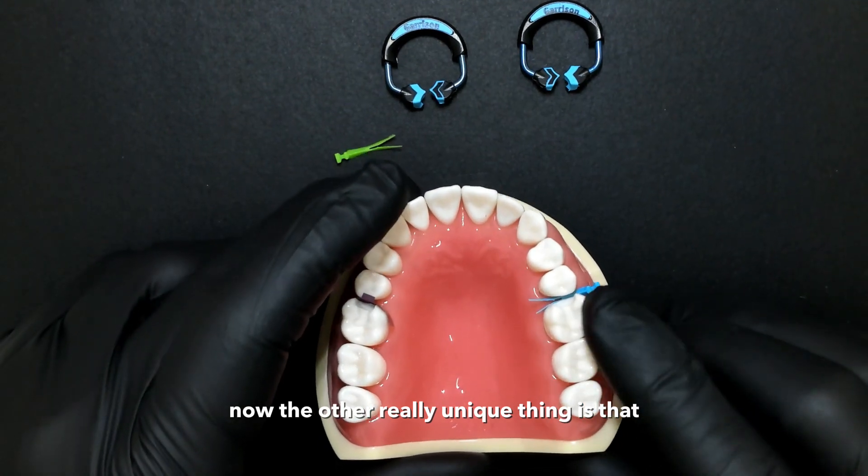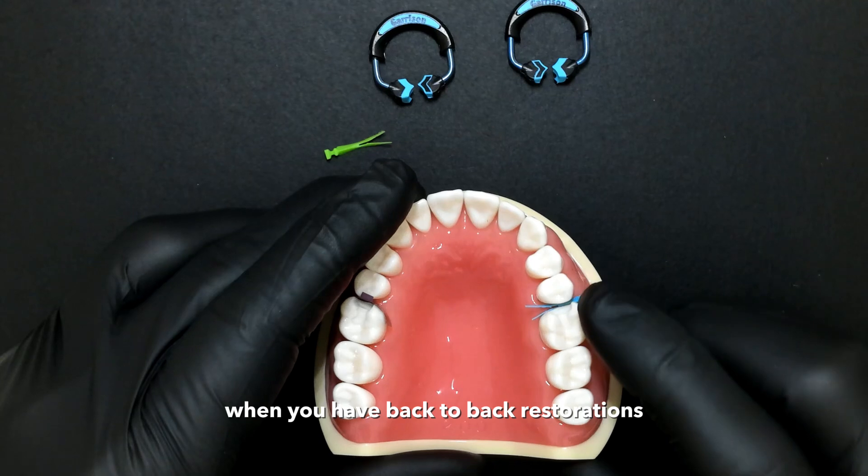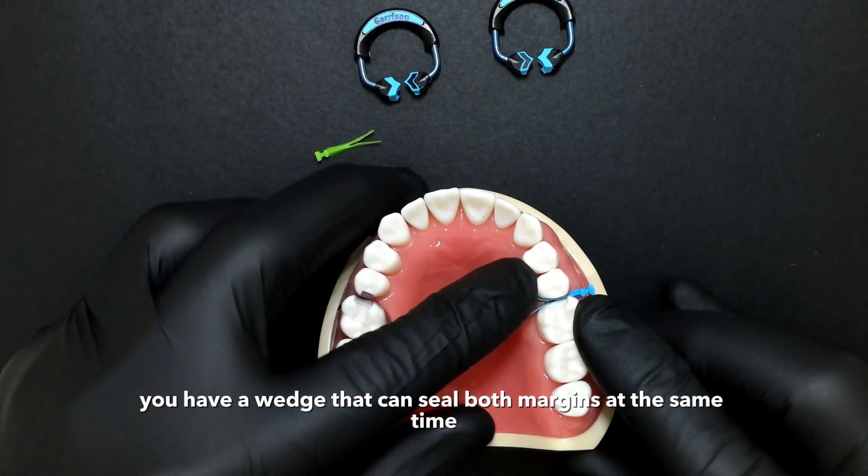The other really unique thing is that by having a wedge that splits in half, when you have back-to-back restorations, you have a wedge that can seal both margins at the same time.